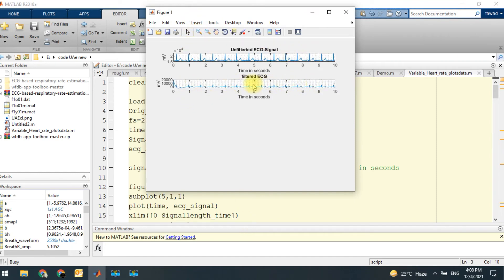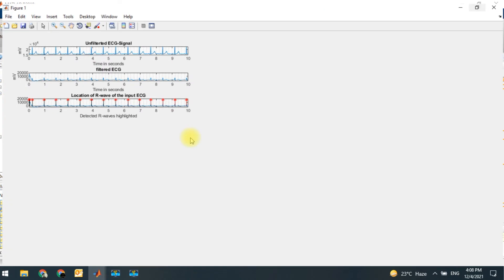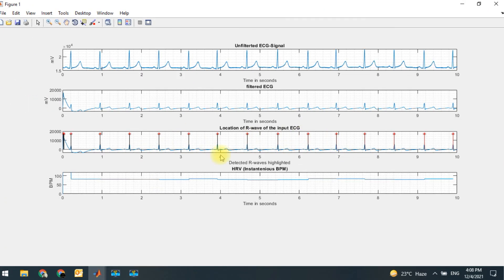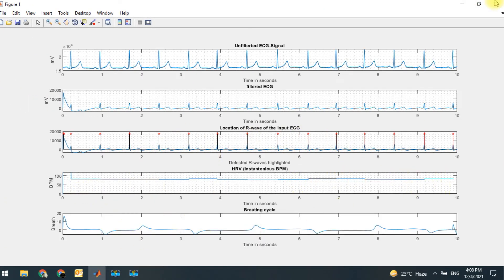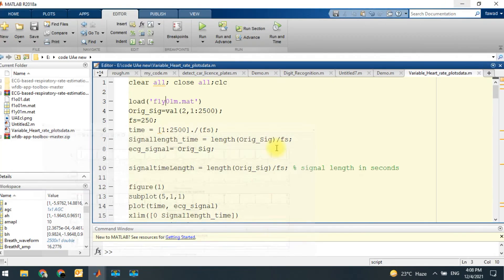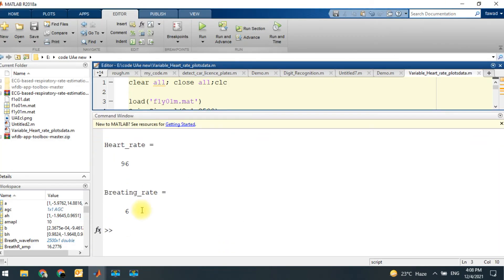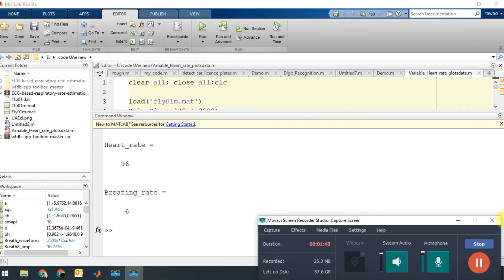You can see this is the unfiltered ECG signal, this is the filtered version, these are the R waves, this is the variability in the heart rate, and this is the breathing cycle. If you look into this, the heart rate of this patient is 96 and the breathing rate is quite low — it is 6.